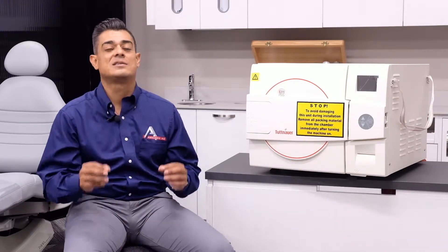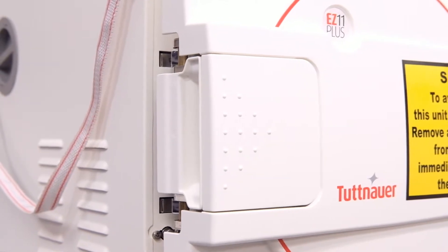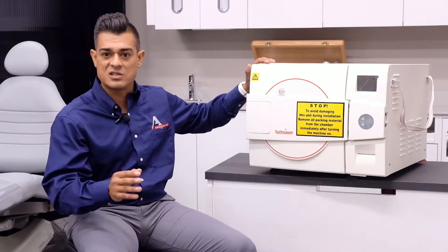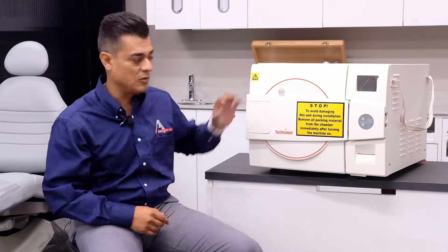I mentioned in the previous video about the newly designed self-locking door — it's beautiful. Why is that such a big deal? With the staff having so many things going on in their day-to-day, just being able to have the peace of mind knowing that if they walk away and forget to shut that door, that sterilization cycle will still keep going. It's a no-brainer. It's going to make your day easier and give you that peace of mind.